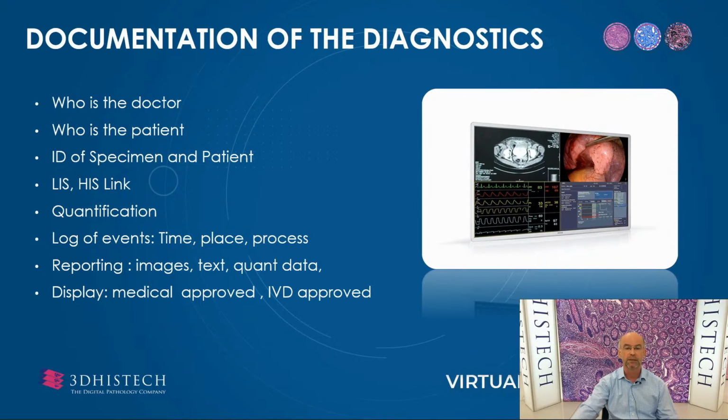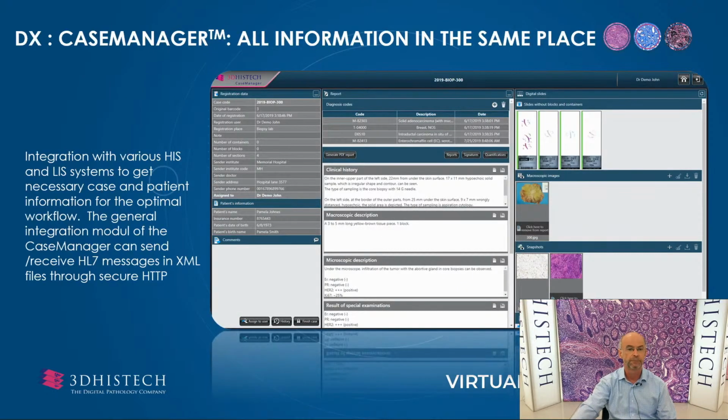We can remember our consultations with the radiologists, that their IT information environment with their scanners, CT, MRI, X-ray, already included these steps after the evolution of the technological opportunities. We work and we can work on displays that are medical device approved, IVD approved, quality and color stabilized.